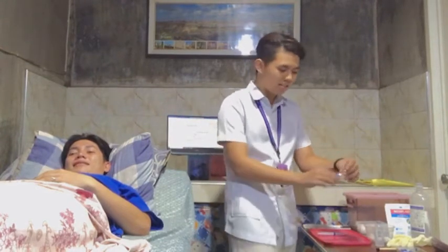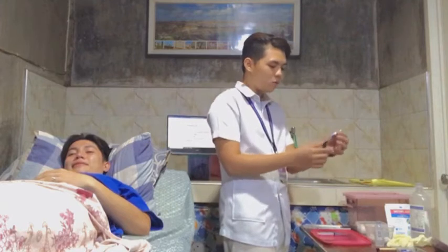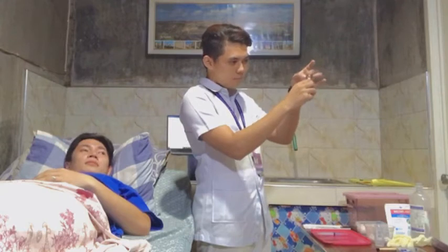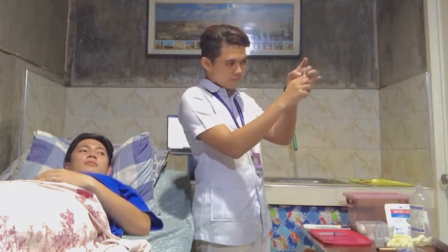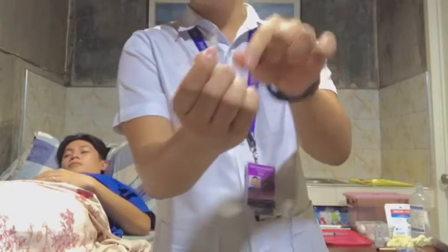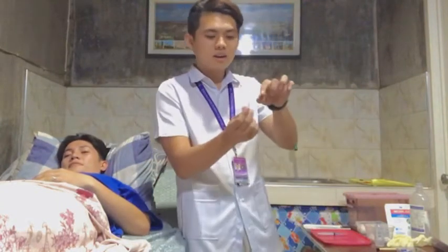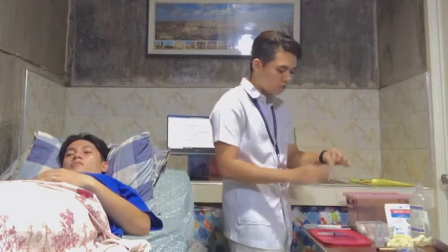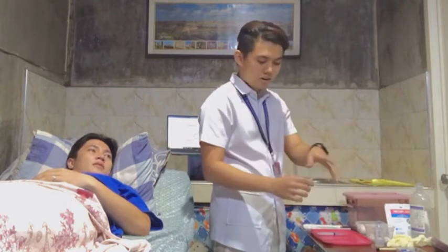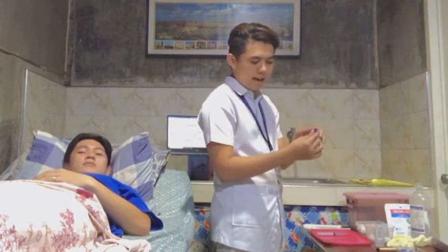So of course, the thing that I have done a while ago is the first safety check. So now we will be doing this ampule. So first, flick this one until the liquid from the top will be transferred below. So as you can see, the liquid is gone, and you will be noticing a dot here. This is the indication where you will break the glass. Of course, you need to break this one away from you so that you will not be hurt, or so that there is no glass left in the medication.